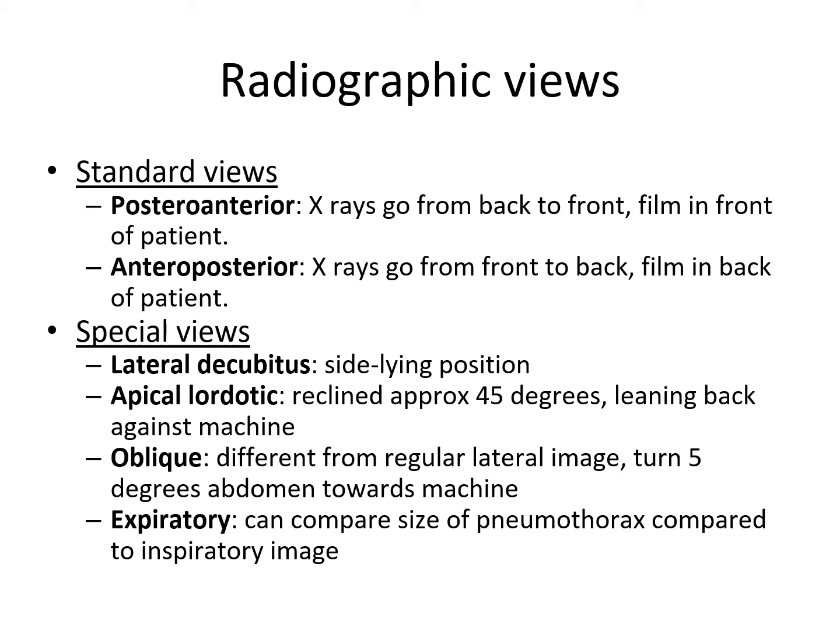And then the radiology tech gets his machine set up and does the x-ray. Those are the ones that, personally, respiratory sees quite a bit. In the ER, it looks a little bit different. A lot of times, because the patients are more unstable, they'll just shoot the film with them laying supine, so they'll slide the film underneath their back. With certain beds, you can actually put the x-ray film in a slot in the bed.